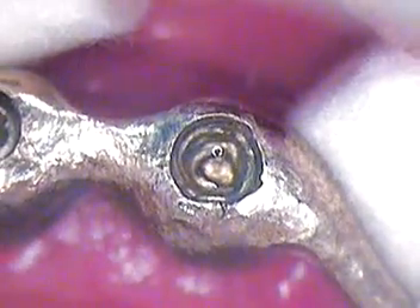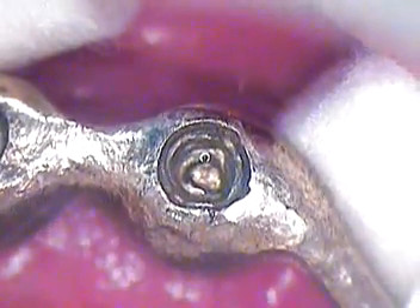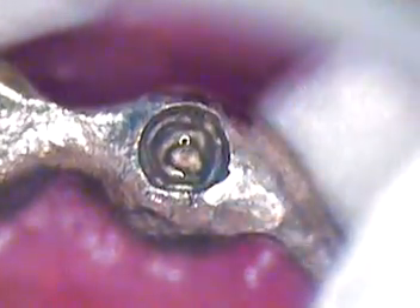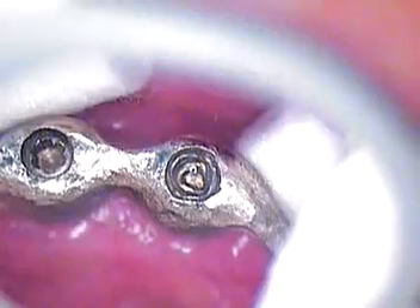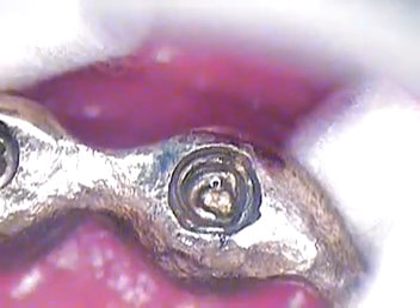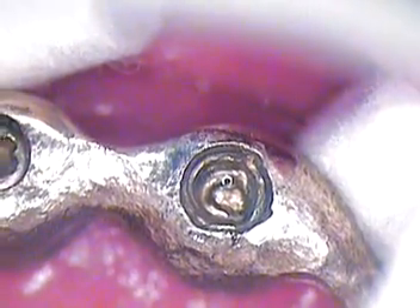Some attempts have already been made to try to retrieve this screw. The patient is going to be heading to a different setup now — going from a removable setup to a fixed. So we need to get this screw out. It's the only thing that's holding up the case right now.